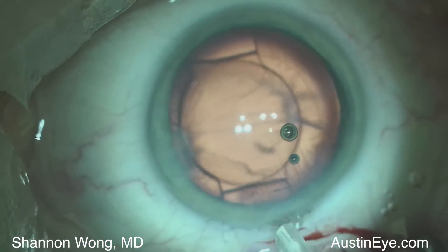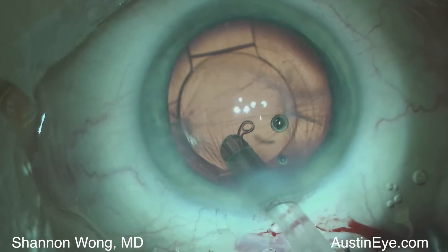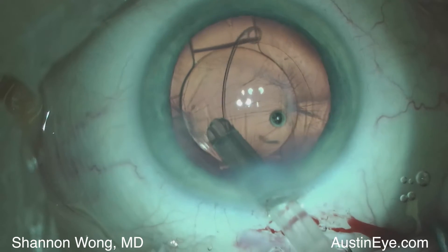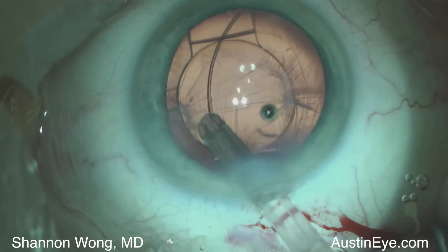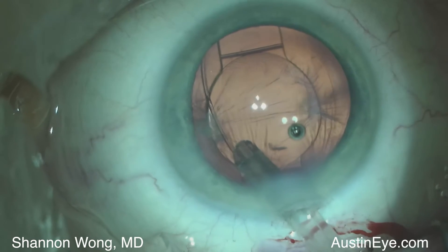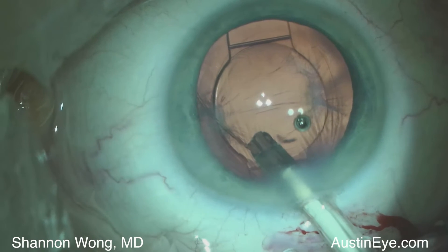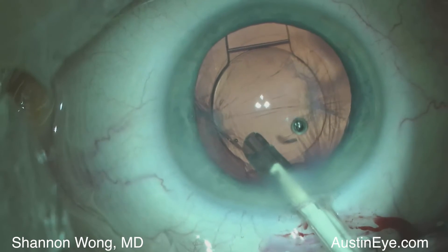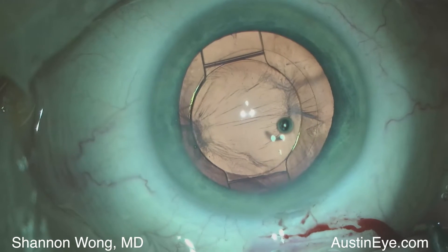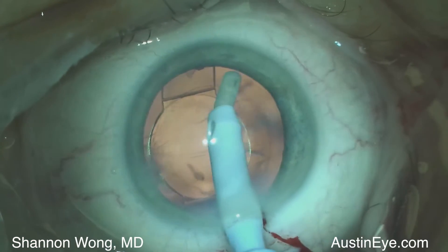We then fill the eye with Helon GV and insert a capsular tension ring. The purpose of the ring is to place expansive forces on the equator of the bag and hopefully to prevent the Z syndrome from reoccurring as the eye heals after the IOL is repositioned.